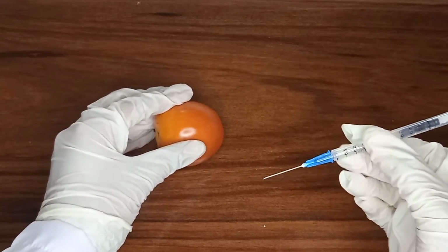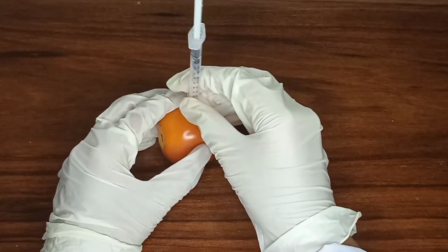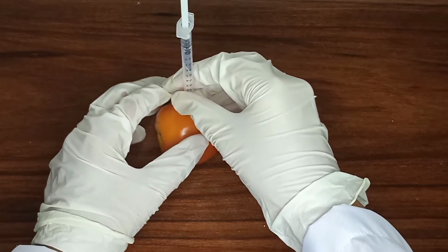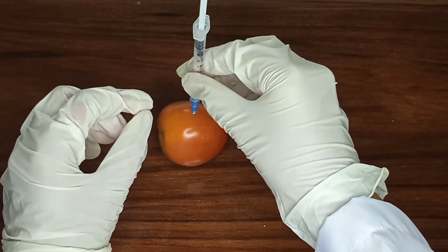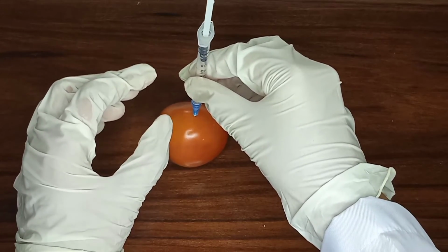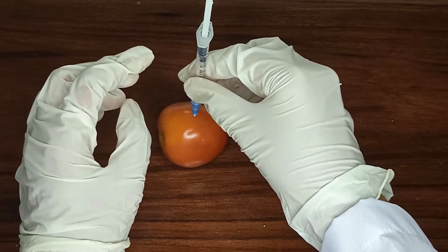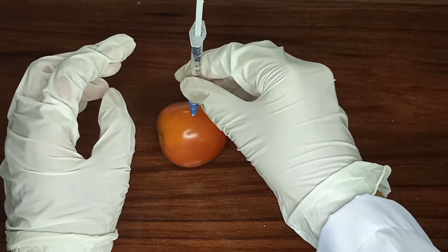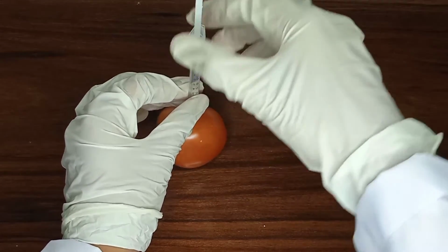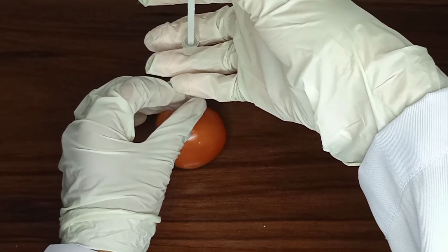Then now we are going to inject. After we inject, we are going to release the skin and grasp the lower end of the syringe with the non-dominant hand and position the dominant hand to the end of the plunger. Do not move the syringe. So here, our non-dominant hand and our dominant hand. And now we are going to inject the medication.